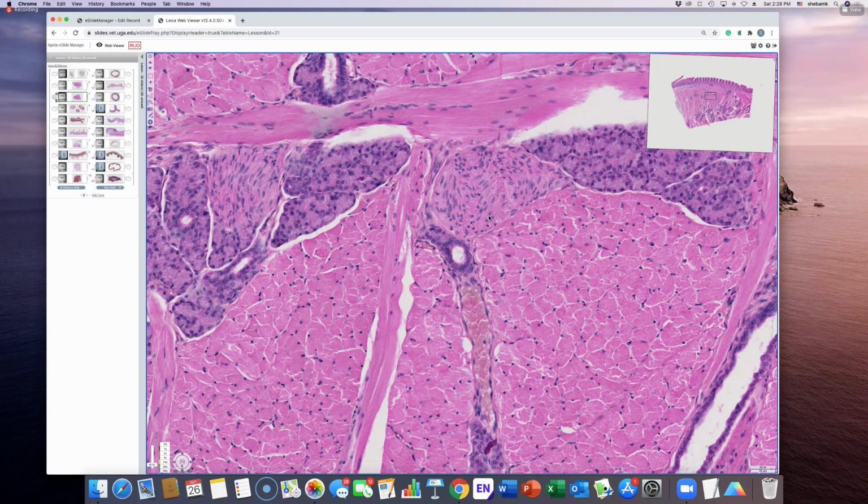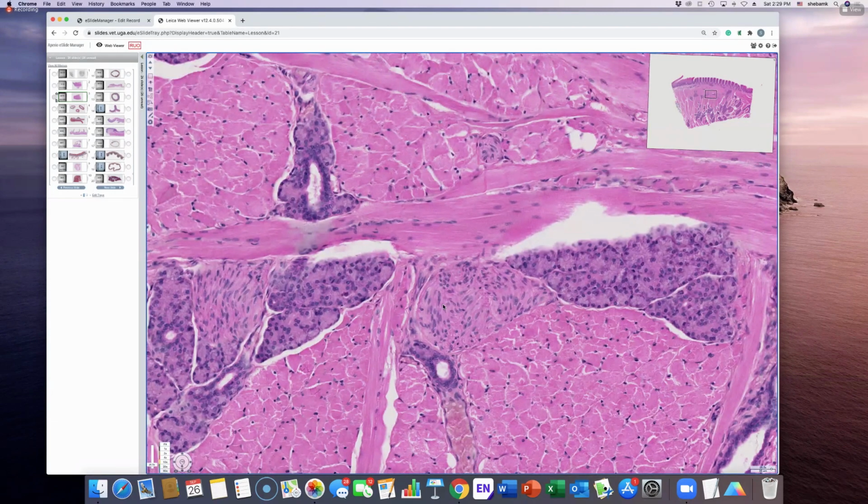Bundle of axons outside of the central nervous system. Not a ganglia? No. If it was a ganglia, you would see neuronal cell bodies with the nucleus, nucleolus, and all of that good stuff. This is just a bundle of nerves. I'm asking whether this is myelinated or unmyelinated. Oh, unmyelinated. Okay, unmyelinated axons. Unmyelinated nerve bundle is what it is. See, look at these. This is what?